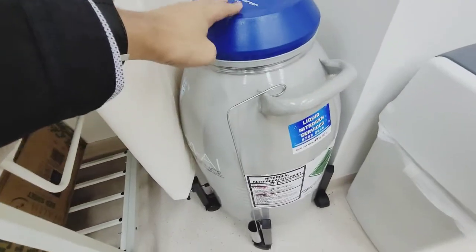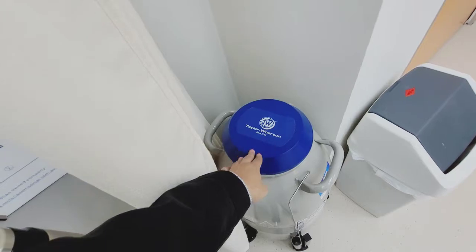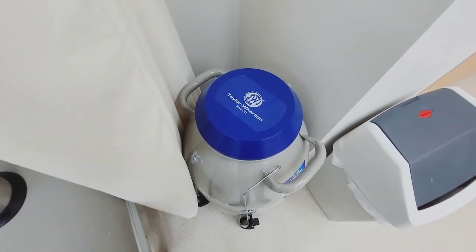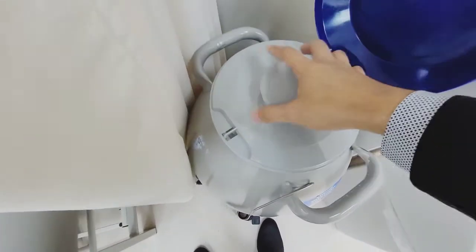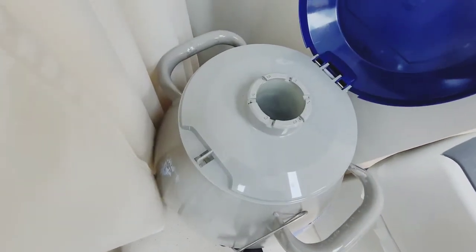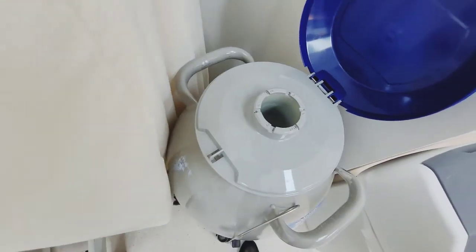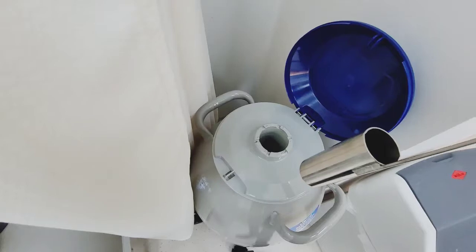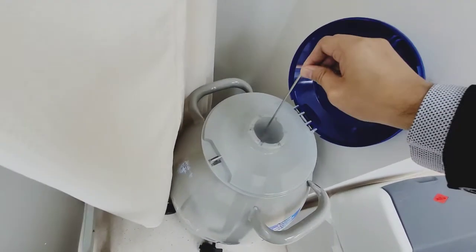a bigger container. There's a lot of liquid nitrogen there. I'll show you. And then I'll use this one to get some liquid nitrogen.